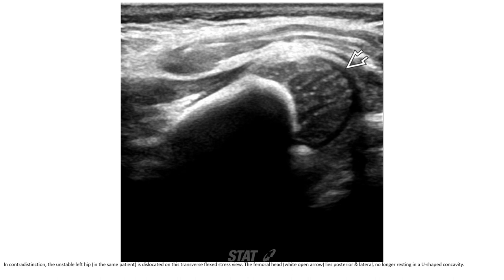In contradistinction, the unstable left hip is dislocated on this transverse flexion view. The femoral head lies posterior and lateral, no longer resting in the U-shaped joint cavity.